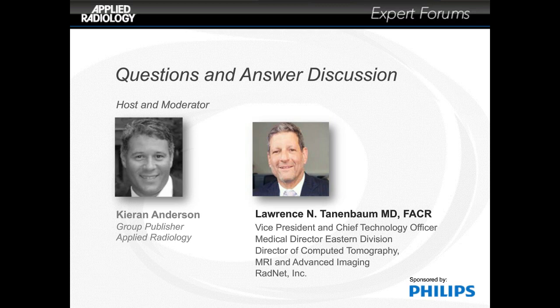I'm a big believer in where AI is. I think, frankly, even compressed sensing done well is a machine learning application. Automatic scanning is a machine learning application. And we are already seeing FDA-approved machine learning convolutional neural network-based image reconstruction tools that just piggyback on top of the advances you heard about with compressed sensing. They essentially let you do today's work faster, maybe 40% faster, maybe 50% faster. And again, they all piggyback together, all of which will point to an exam in MR where at some point you may even be able to just walk in, grab an MR and go without even making an appointment, as long as you have the appropriate doctor's orders.